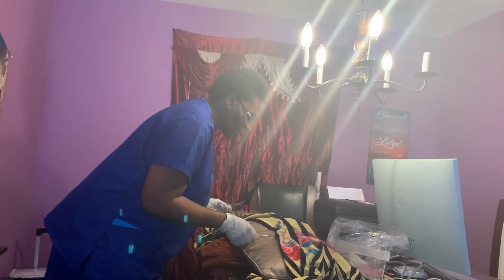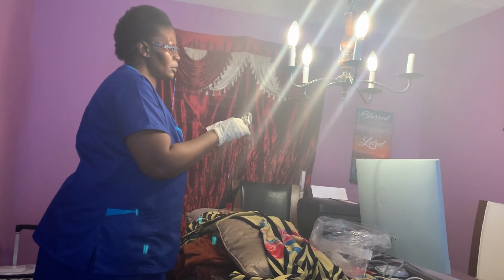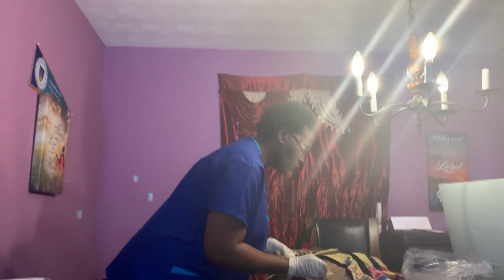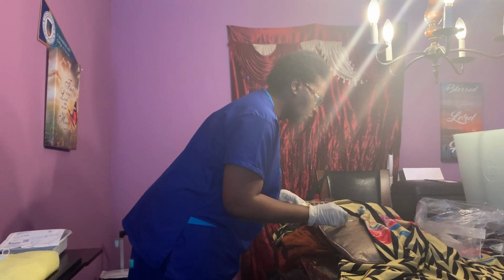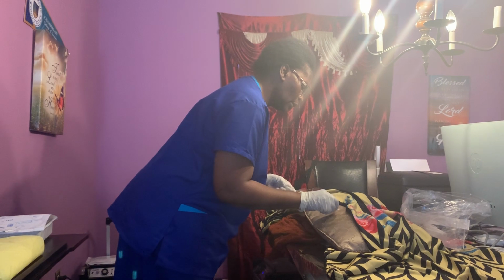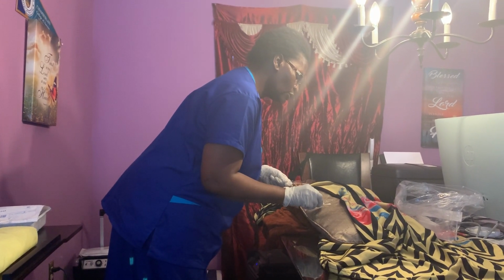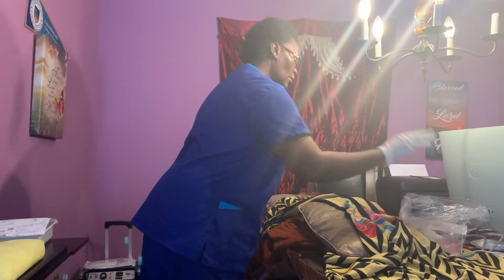Okay, I'm gonna use my Q-tip. Okay, and then I'm gonna measure, and that looks like a 3, so 4 by 3. And then I'm gonna also check for any tunneling. So I can see there is tunneling here. This is 12 and this is 3, like 3 o'clock. The arrow is on the 3, so that's where I have some tunneling. So the patient will need packing, and then I will get rid of that.